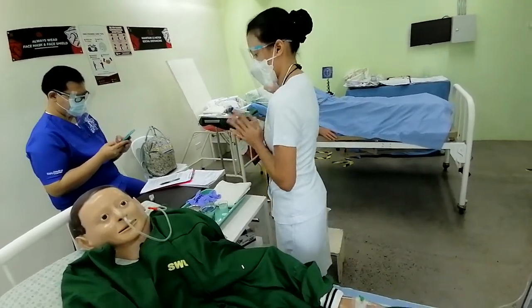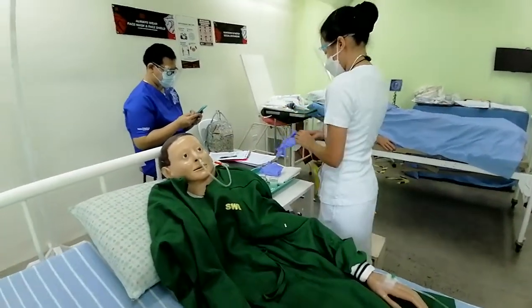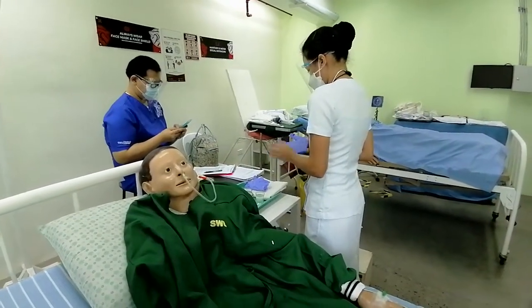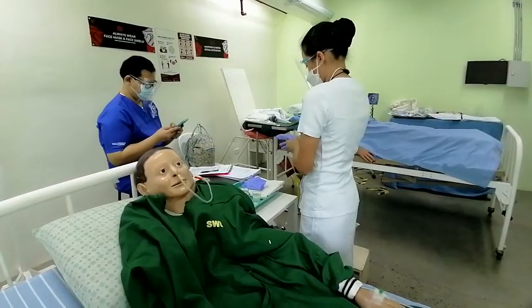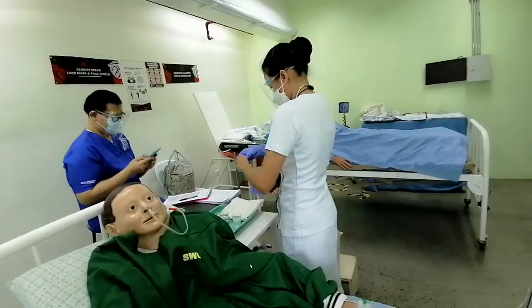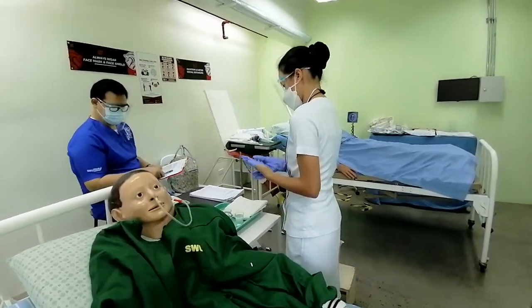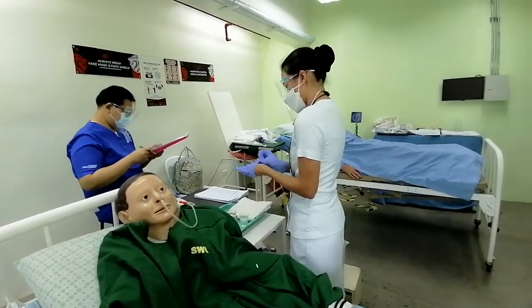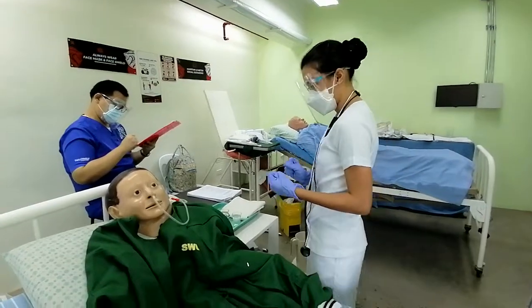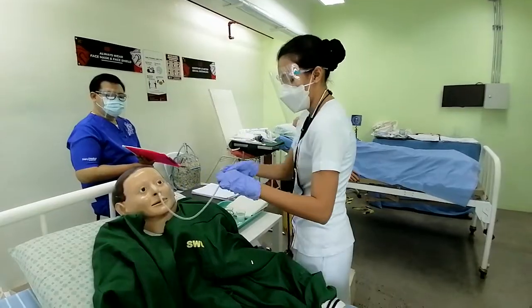So, assuming I'm done hand washing. Then after which, I will go to the patient and check for the placement of the tube, just like what I did earlier.